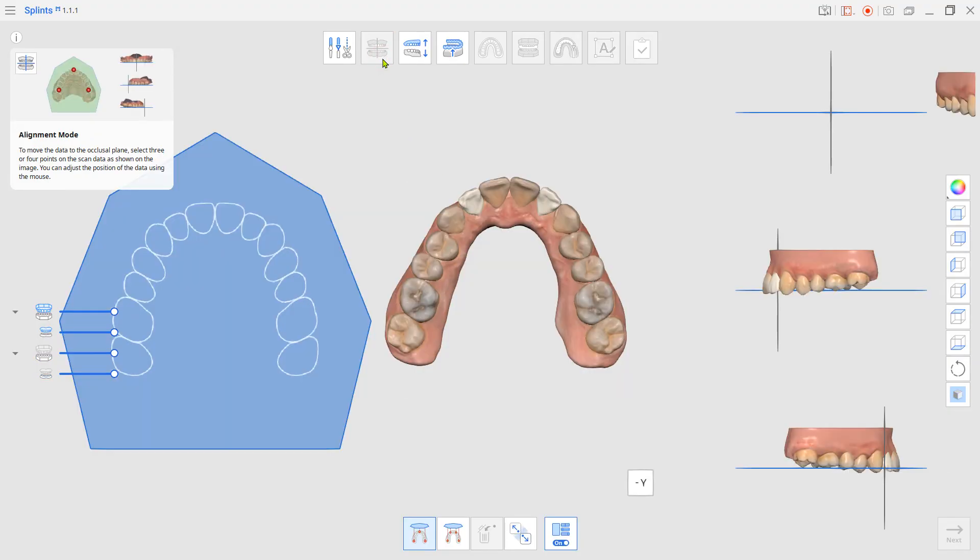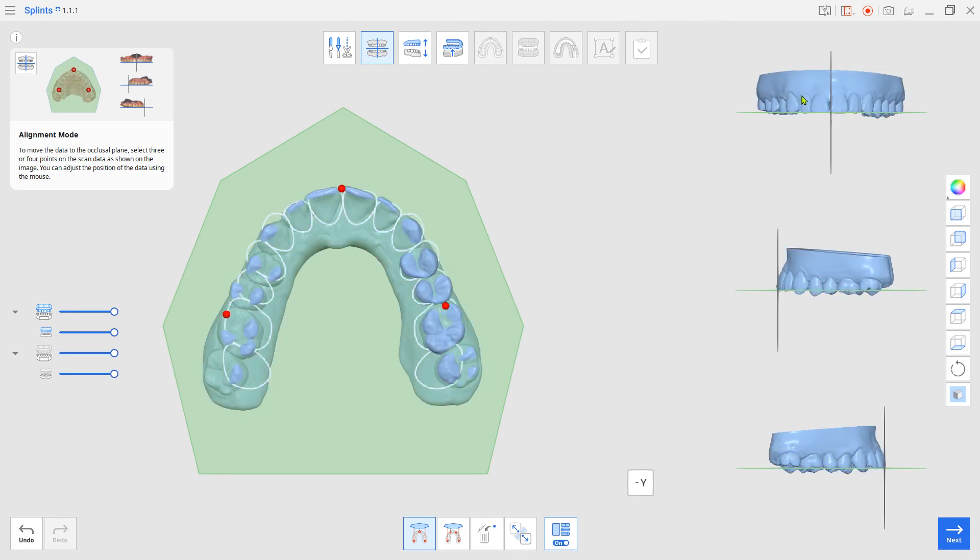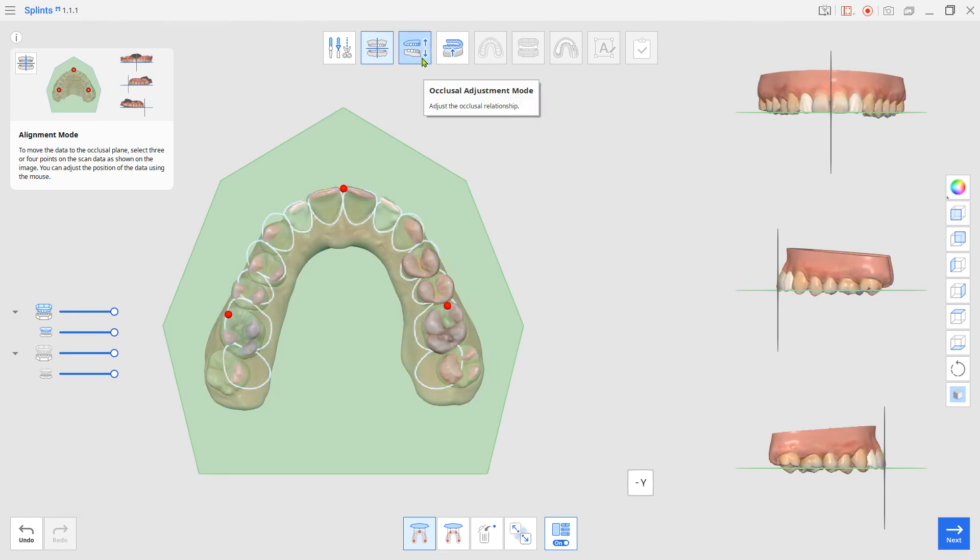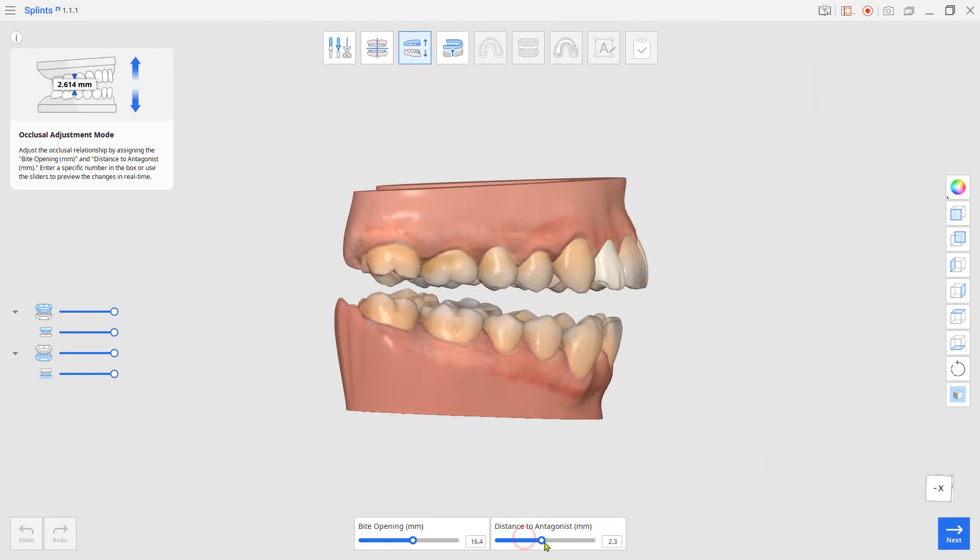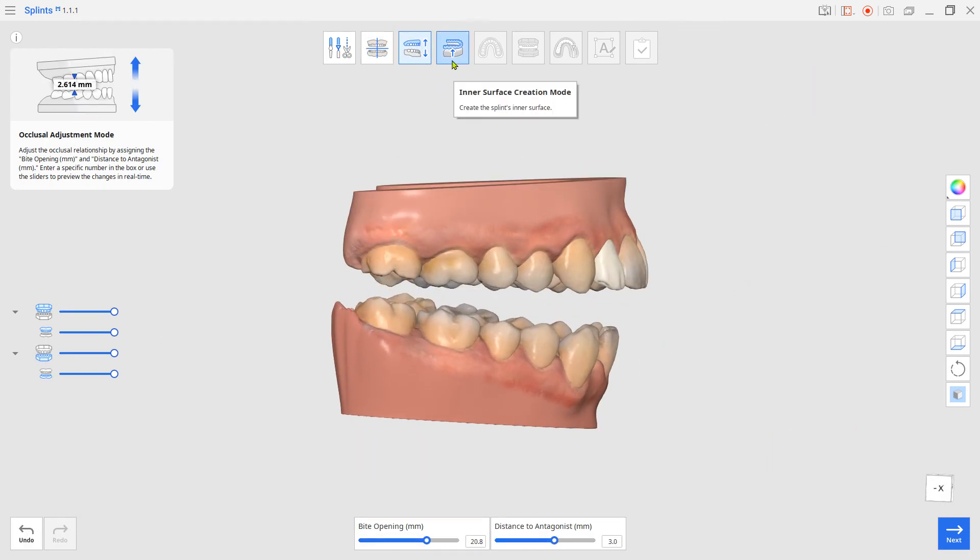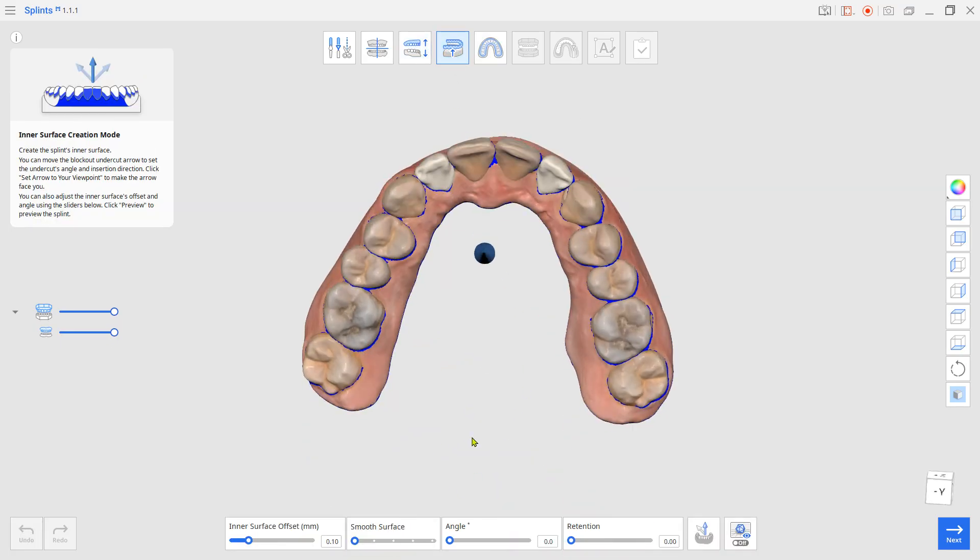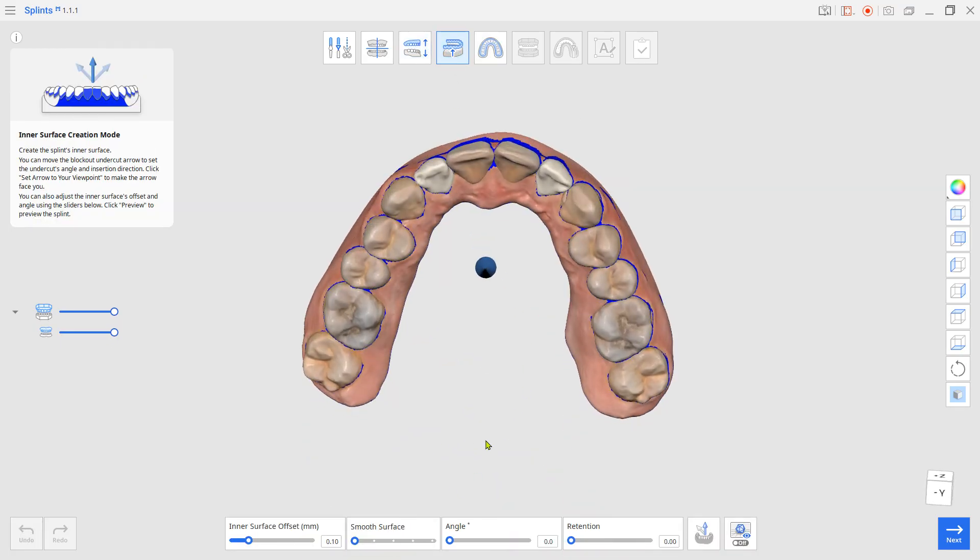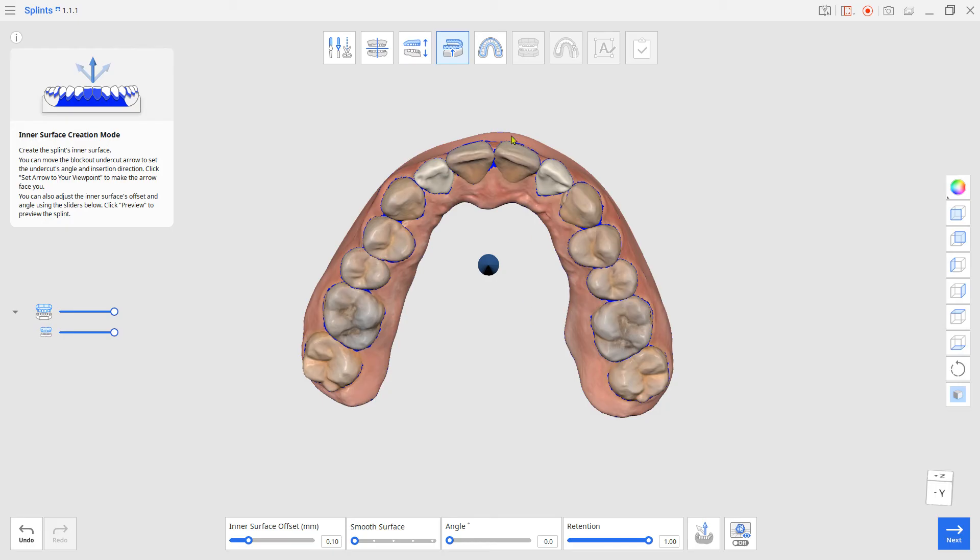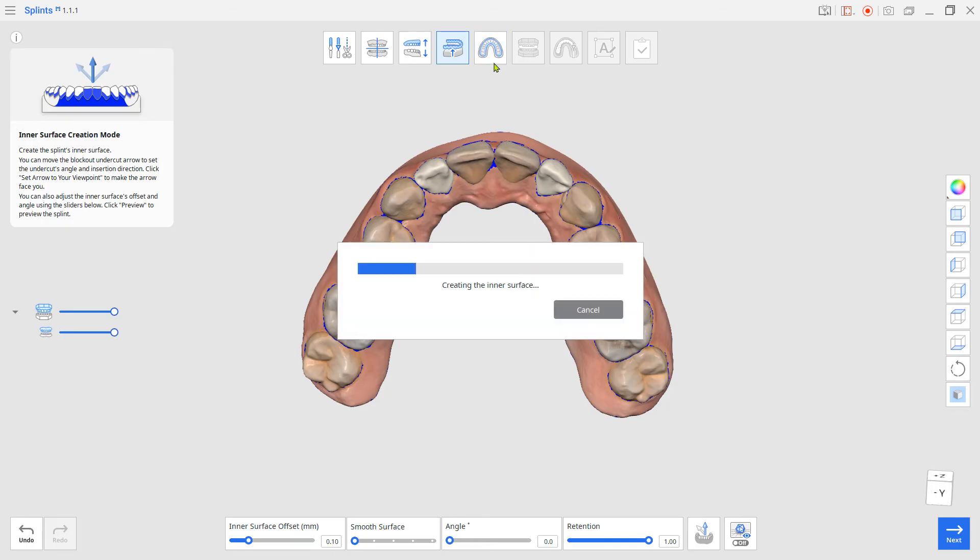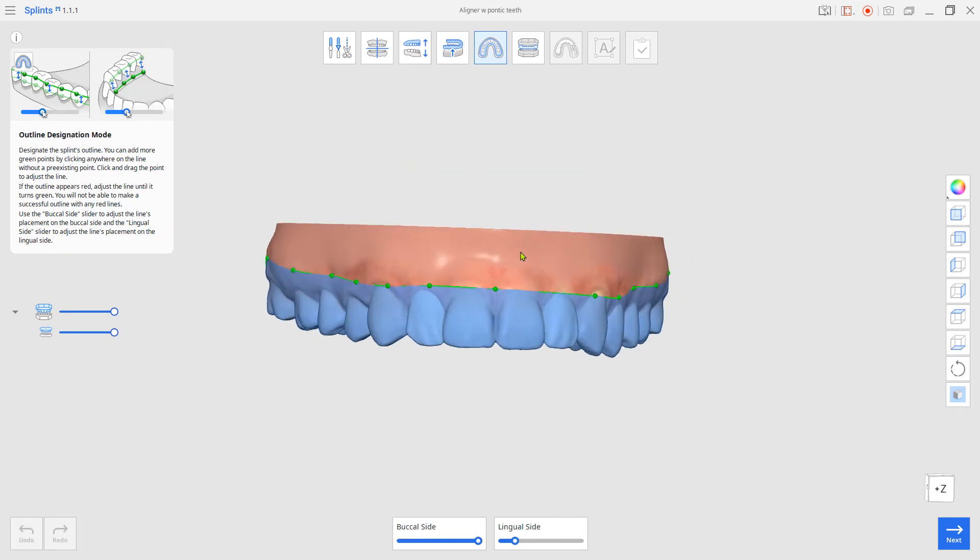Set up the teeth along the process. In inner surface creation mode, set the inner surface offset and insertion path. Give the maximum on the retention. Set up the margin.